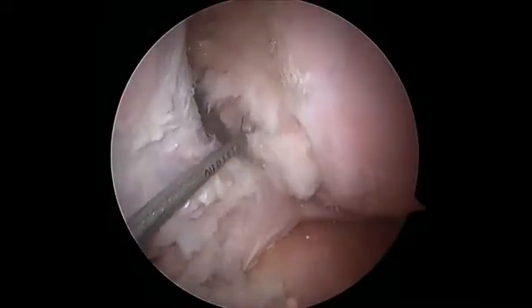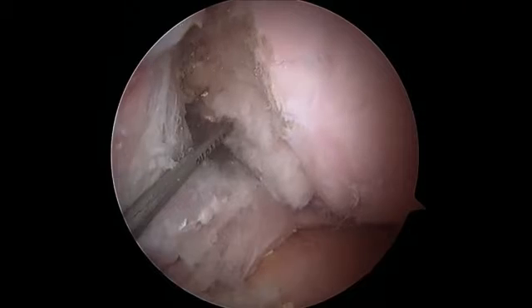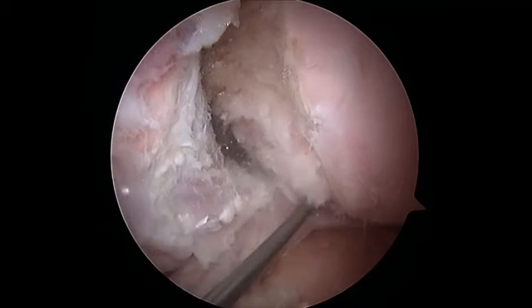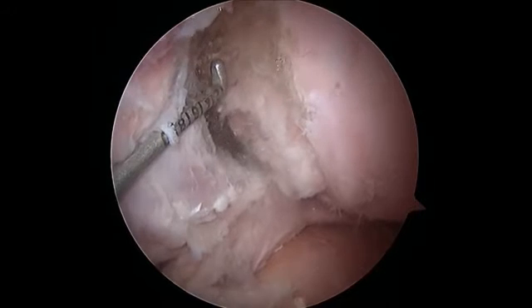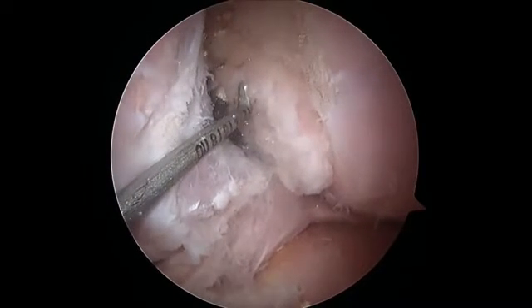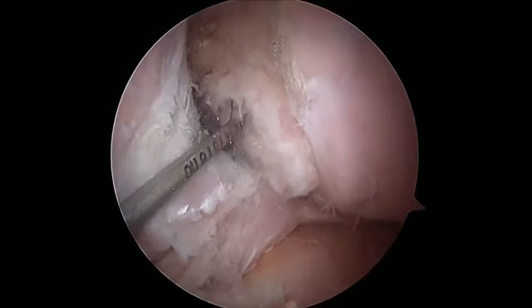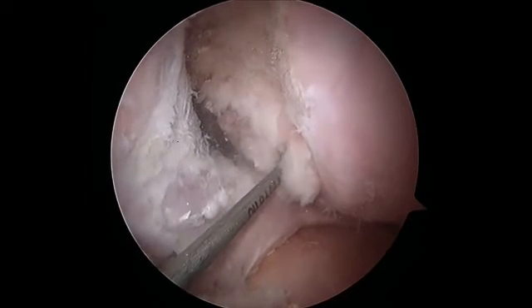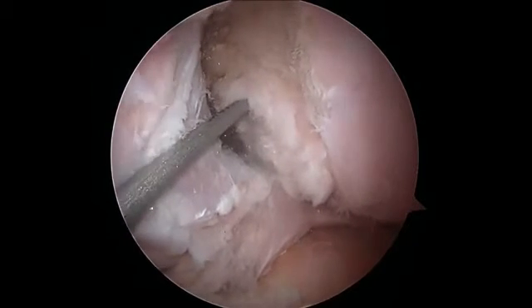I'm going to get you oriented. This is proximal or deep. This is shallow in the notch or distal. This is low in the notch or posterior. And this is high in the notch or anterior. Dr. Howell and McAllister and I are not going to be talking about the AM and the PL tunnel position, but if you want to use that nomenclature, this is more of an AM region and this is more of a PL region.